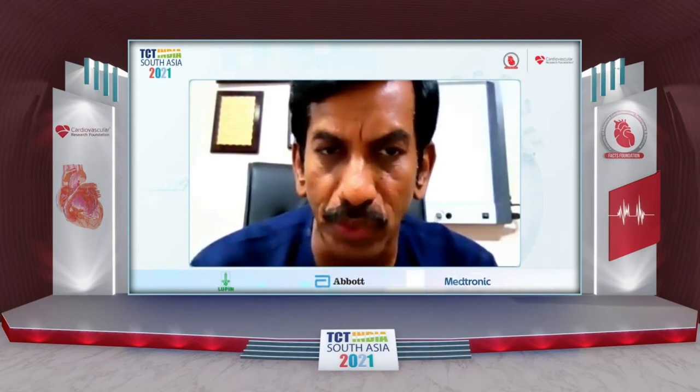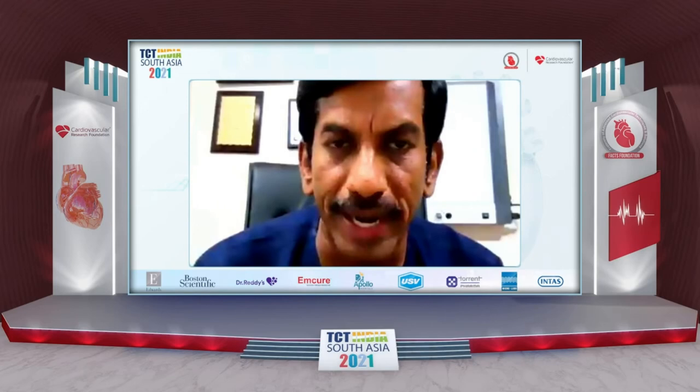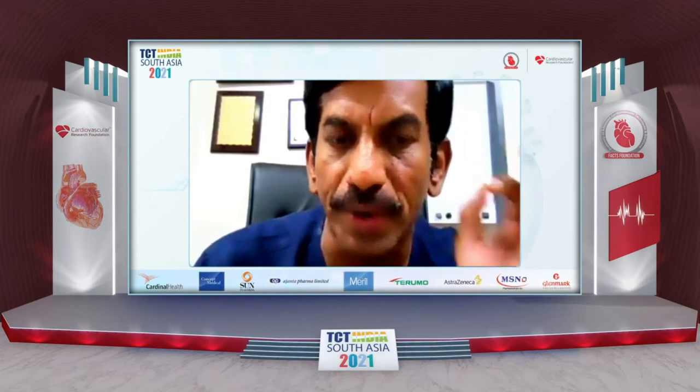Exact length of the lesion: you can choose the angiographic landing zones, and with the balloon, you put it in the distal landing zone and use something called the reset button here. Then drag it back to the proximal landing, and you can have an exact, sub-millimeter measurement of the landing zone to landing zone. This is one part of the robotic PCI precision, which we can use in the procedure.